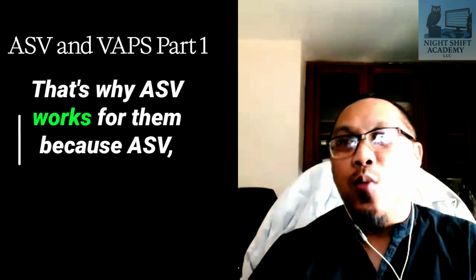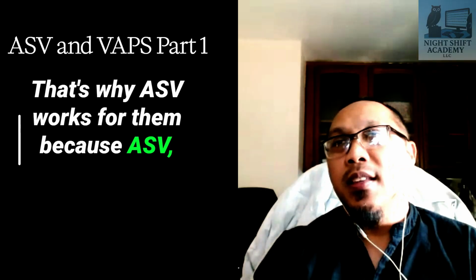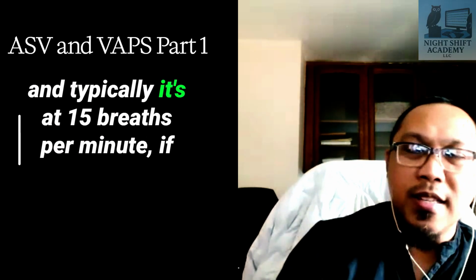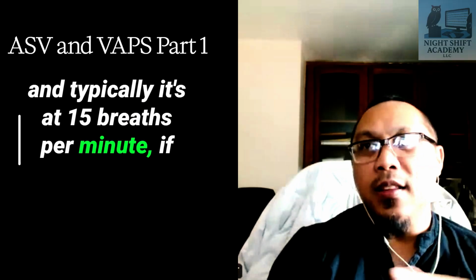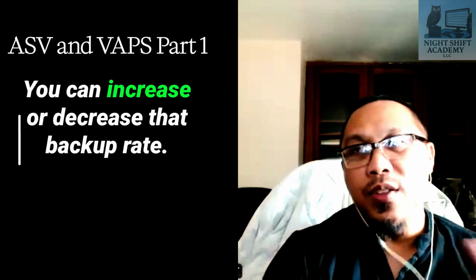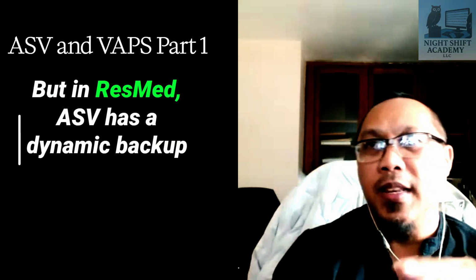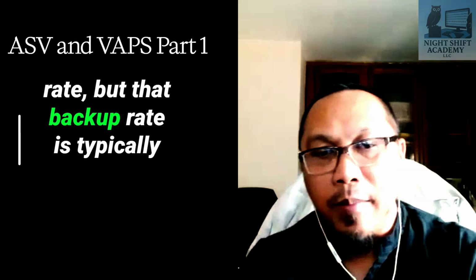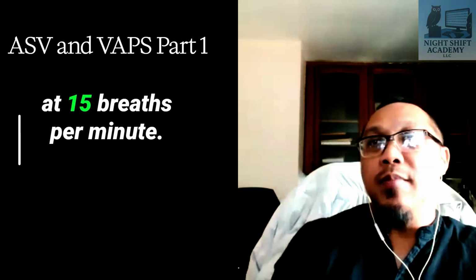That's why ASV works for them, because ASV has a backup rate, and typically it's at 15 breaths per minute. If you put it on manual mode with Philips, you can dial it down or up. You can increase or decrease that backup rate. But in ResMed, ASV has a dynamic backup rate, but that backup rate is typically at 15 breaths per minute.